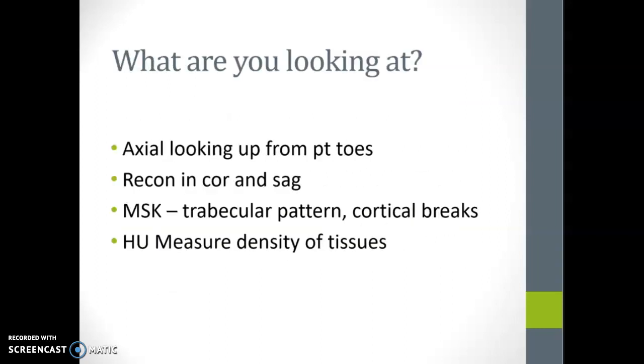So what are you looking at? You're looking at an axial view, looking up from the patient's toes, and it's reconstructed into the coronal and the sagittal planes. Within MSK, you can see bone in much better detail. So you're able to see the trabecular pattern and the cortical breaks.